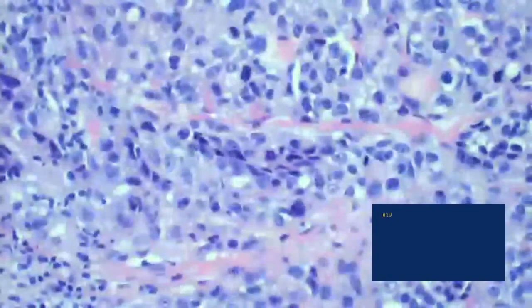So if this is a malignancy, and it sure looks like it now, doesn't it? All the atypical cells, and it looks kind of epithelioid. And some of the cells may be arranged even in these little aggregations here. What do you call a cell cluster in a little round? A nest. So what do you think of when you have a nested malignant neoplasm? We think about melanocytes, like melanoma. So this could be melanoma.